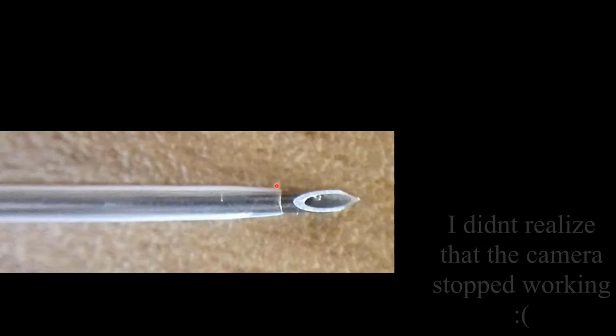Now you can see the tip of the cannula is slightly narrower as compared to the body of the cannula. Now this narrow tip forms a watertight seal around the stylet. So when this stylet is pulled back, the seal is broken and hence the blood is being pushed between the walls of the stylet and the cannula.